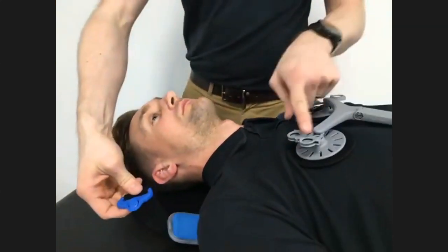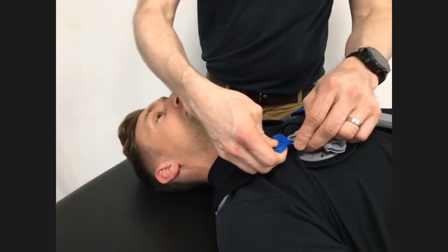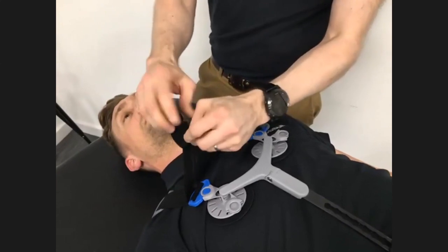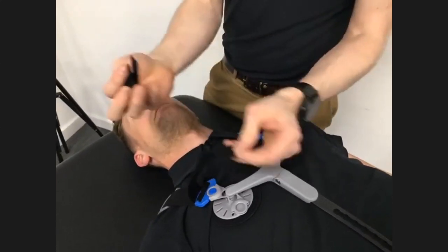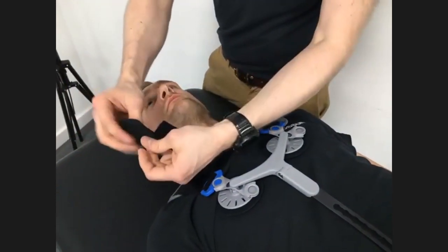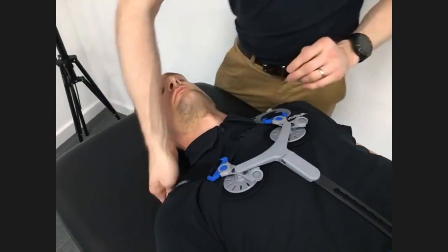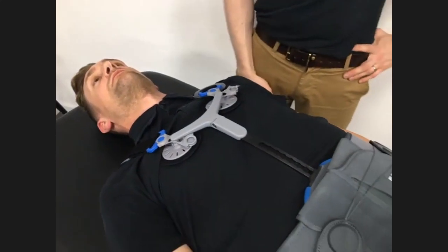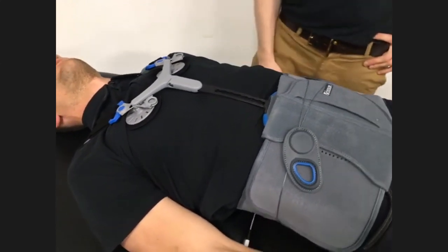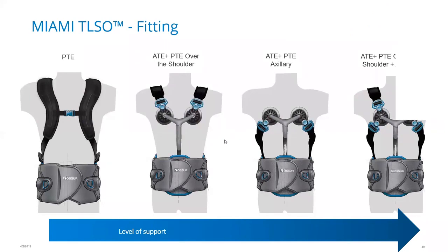And then over the shoulder, ignore these extra clips here. I'll be mentioning those in a little bit. Bring this over and clip that into position. And you can see that these have crocodile Velcro sections in order to adjust it. So those can be adjusted depending on need. You can tighten those up and then tidy up those two ends like that. Perfect. So we've got it positioned nice and centrally, everything in position. What we're going to do now is pop briefly back to the PowerPoint, and then we'll talk you through those configurations, and then I'll show you how you can set those up.